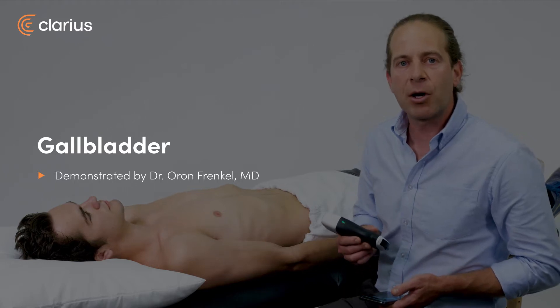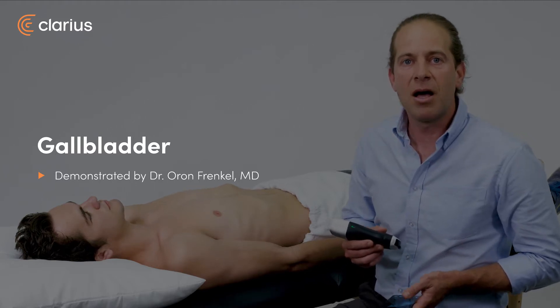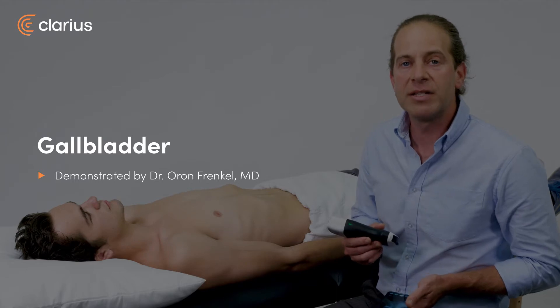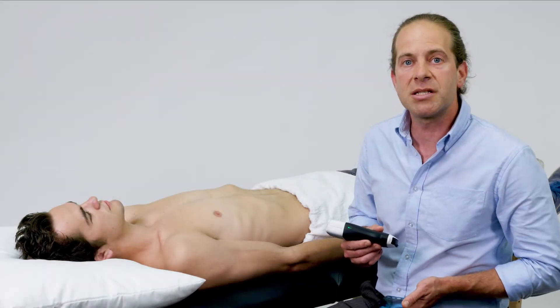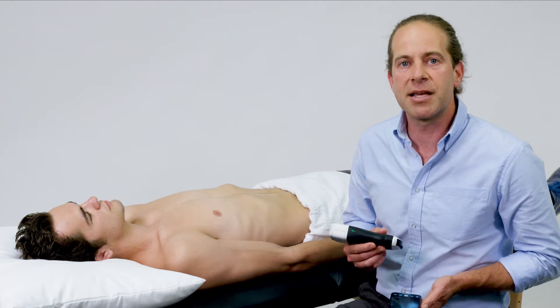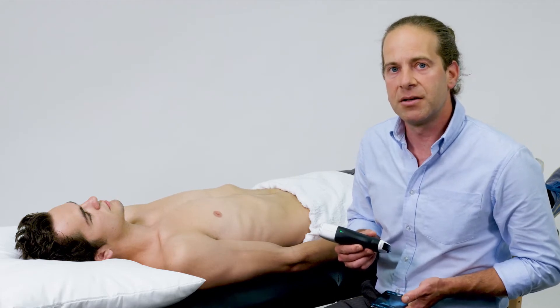In patients presenting with right upper quadrant or epigastric pain, unexplained nausea or vomiting, or even sepsis, signs of cholelithiasis, cholecystitis, and choledocholithiasis can all be quickly identified at the bedside.